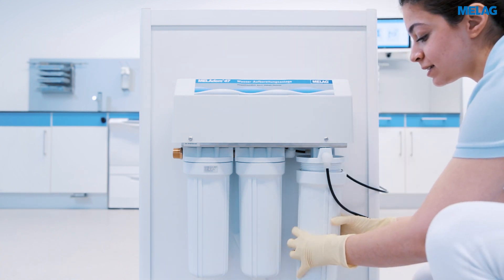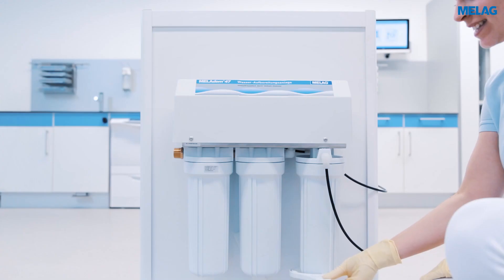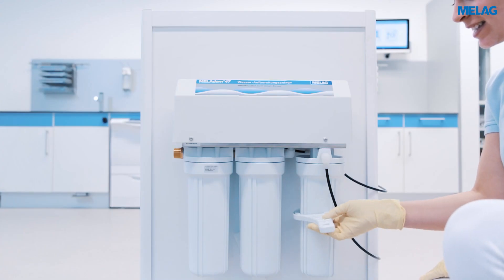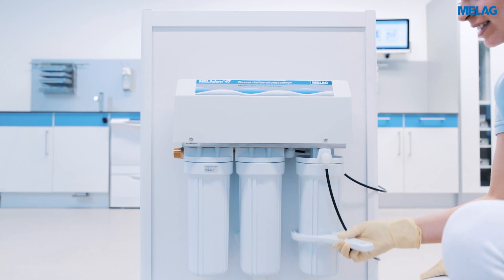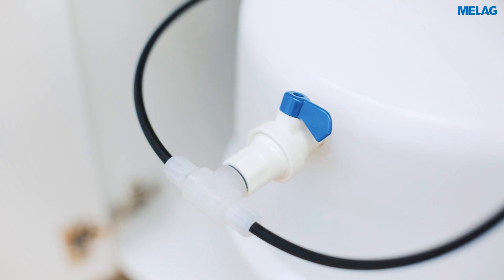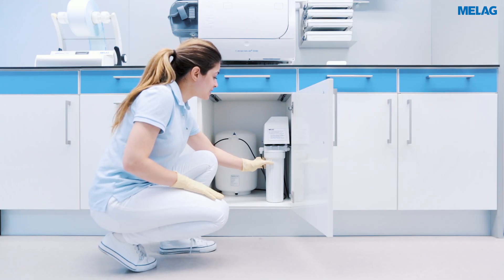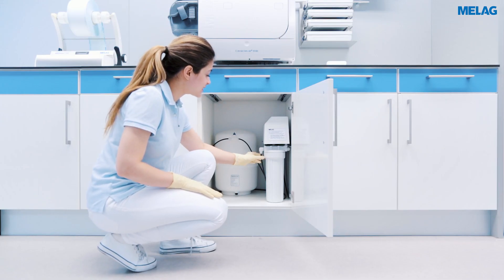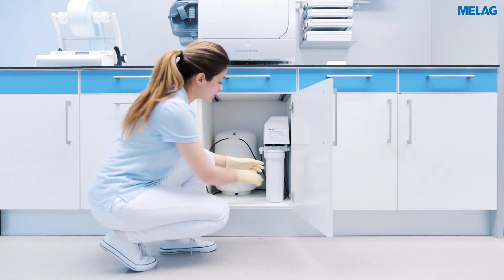Screw the container tight, first by hand and then using the container key. After you've turned on the water tap and the shut off valve again and checked the MELAdem 47 for leaks, your CareClave and the water processing system are now ready for operation.